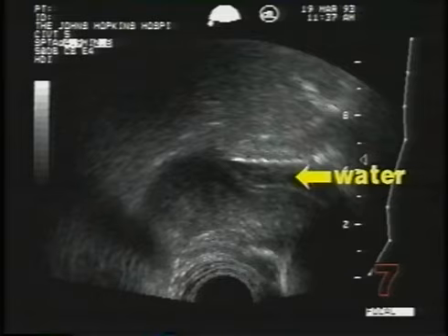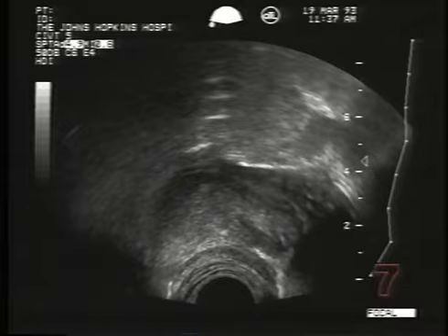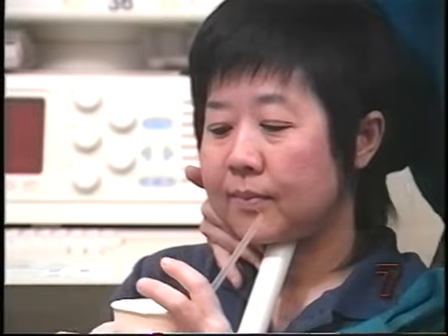While the water is held steady in the mouth, we can see the palate bone because the ultrasound passes through the water all the way to the palate. As the subject swallows, we see the hyoid, or the shadow of the hyoid, usually on the left side of the image, swing up and into the picture and then back out. When the hyoid is at its maximum position, we know that the airway is protected.